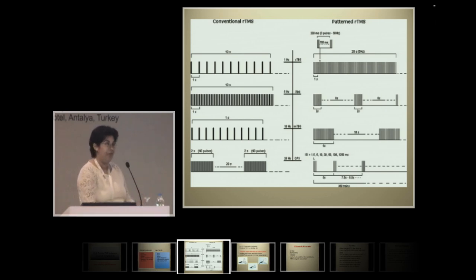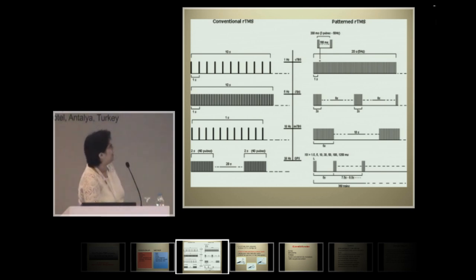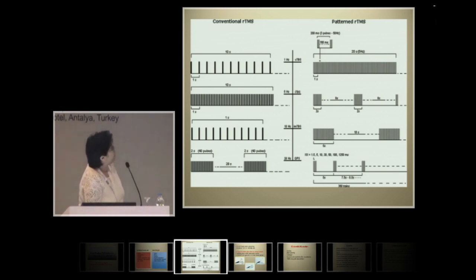One says, it took me only 10 minutes. The other one says, my treatment took 45 minutes. One patient is treated with 1 Hertz, and the other patient is treated with 20 Hertz. This creates a difference, of course.